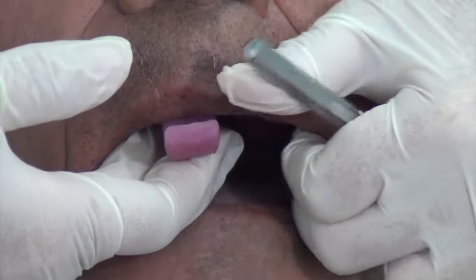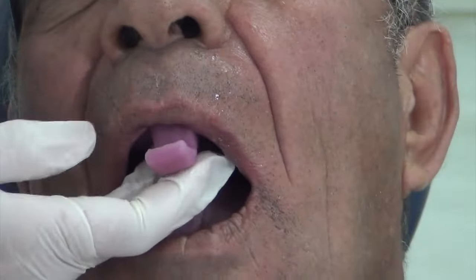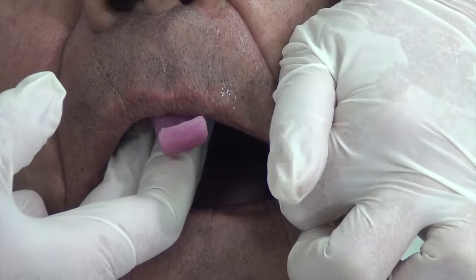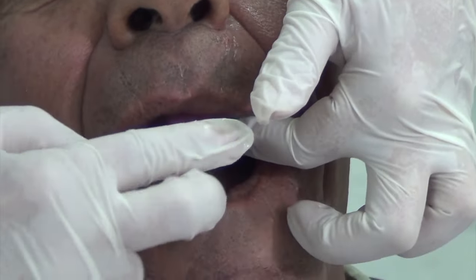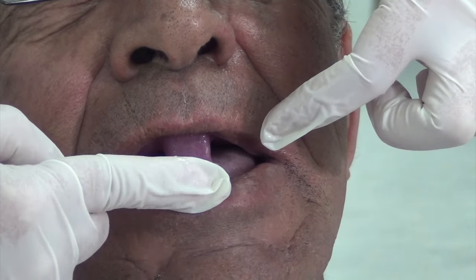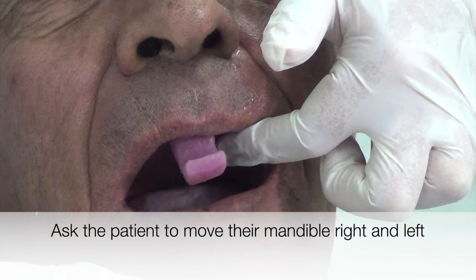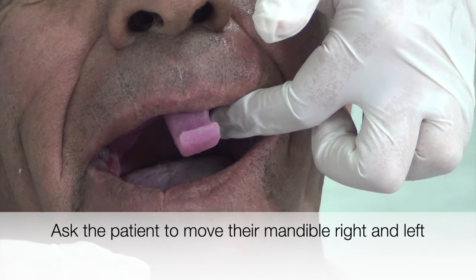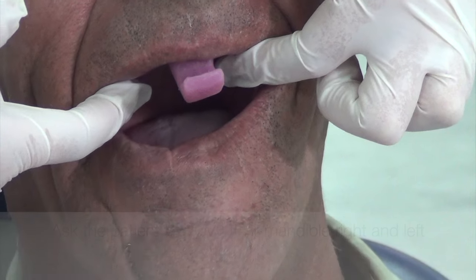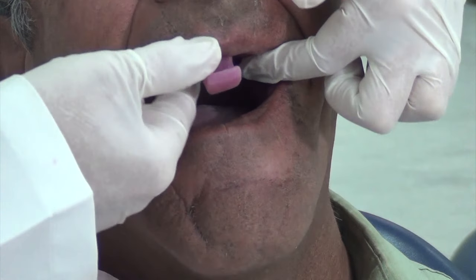Seat the tray into position. To border mold the buccal frenum, move the lips and cheeks gently in an upward, outward, and then downward direction. This movement will border mold the effect of the muscles of the modiolus, which is a collection of muscles of facial expression located at the corners of the mouth. Next, ask the patient to move their mandible to the right and left. This will record the distobuccal vestibule of the maxillary denture, in addition to recording the coronoid bulge, in which the coronoid process of the mandible affects the width and height of the distobuccal vestibule.